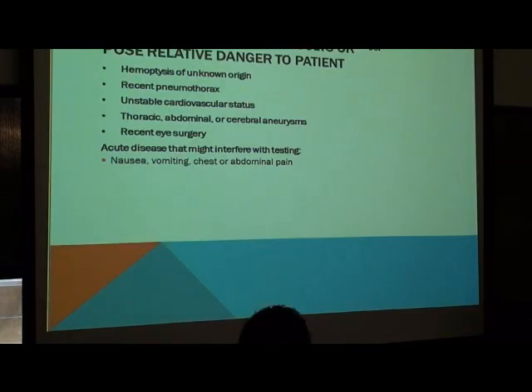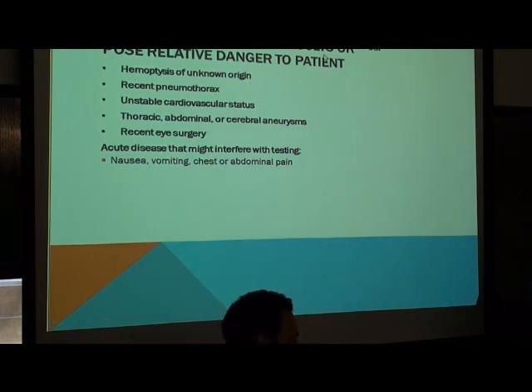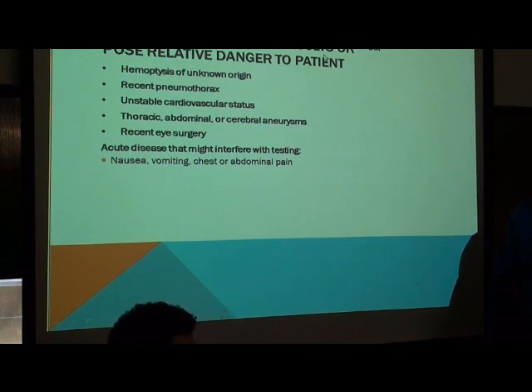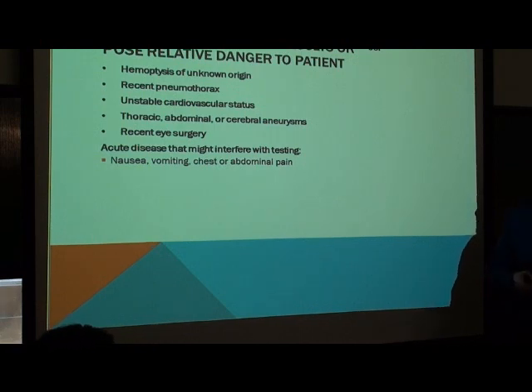Sounds good. All right, so basically everything on this list is something you should be aware of that may cause either less than optimal results or pose a risk to the patient. And so we kind of take this as relative risks. These aren't contraindications. Again, basically everything on here we see on a regular basis.